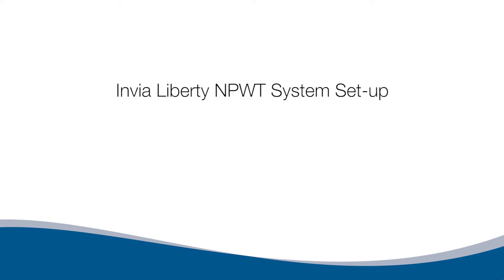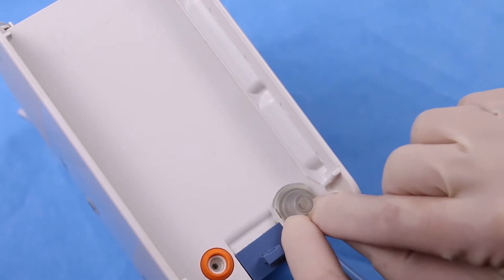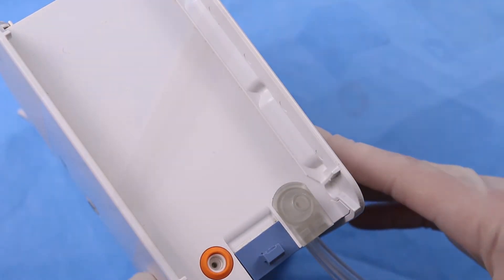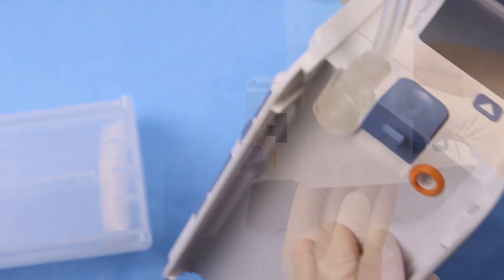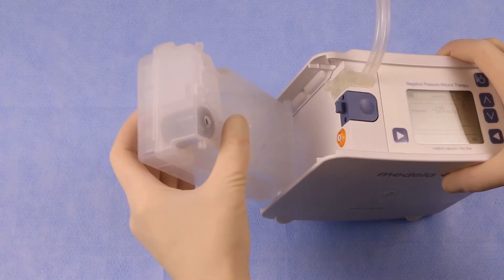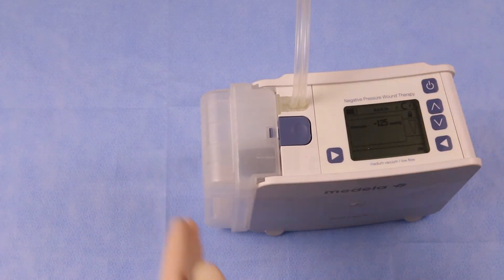Invia Liberty Pump Setup with Disposables. Connect the Invia Liberty canister tubing. Insert the tubing base into the pump and make sure the tubing is flush with the pump. Ensure the orange O-ring is in place. To click the canister into the pump, slip the pegs at the bottom of the canister into the slots at the base of the pump. Lift the canister towards the pump until an audible click is heard. The canister secures the tubing.